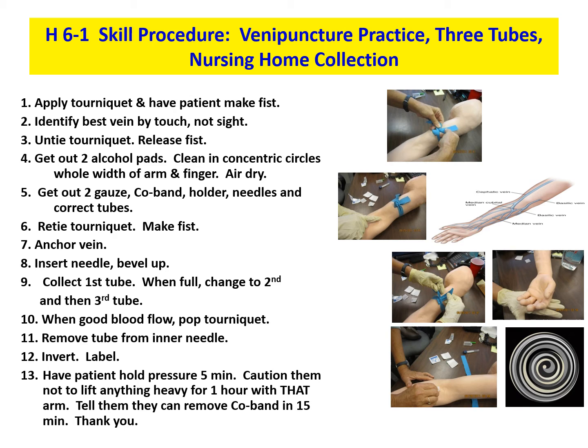And then remember, you don't want to leave that tourniquet on there for any longer than a minute. So you want to go ahead and get that tourniquet off once you've located your vein by touch and you visualize exactly where you're going to stick your patient. And then we get out just our 2 alcohol prep pads, right? So make sure, we went over this today, Monday. We went over this over and over again. We're getting closer and closer to taking our venipuncture skills test so that we can stick for real, okay?